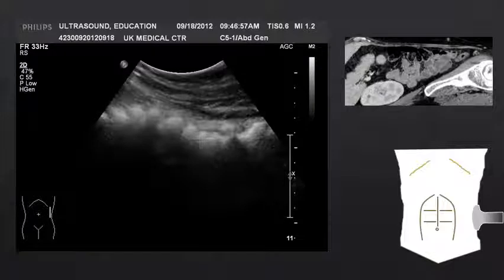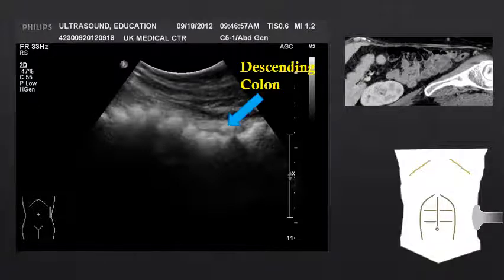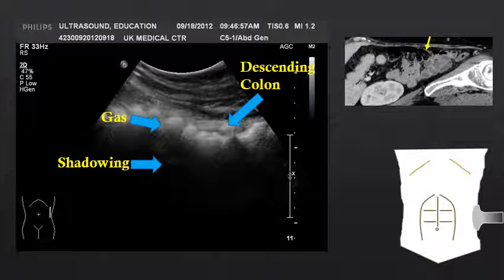Here is an example in the left abdomen with a sagittal or coronal orientation, where we see the descending colon. The descending colon is filled with gas, and this gas is resulting in posterior acoustic shadowing.